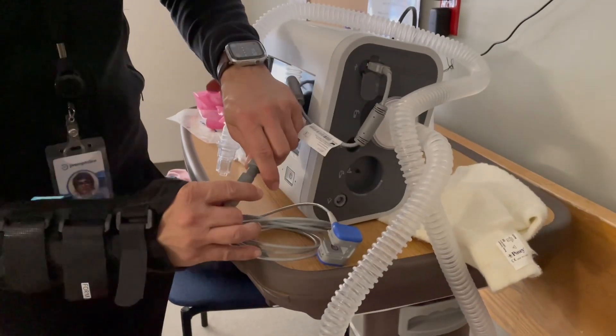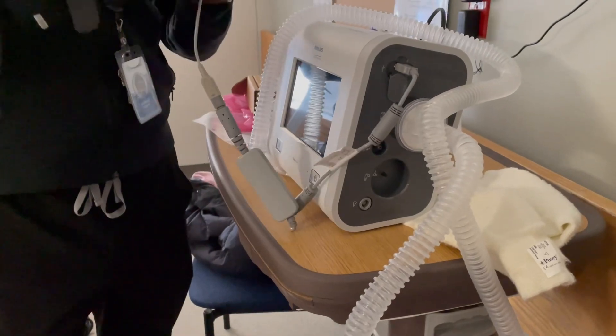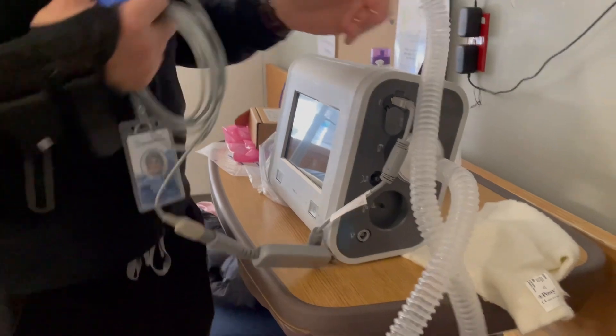In my five years, I've never actually discharged a patient on end-tidal — that's why it's so rare. If you can get a patient without having to add all these things to their ventilator, then try to do that.